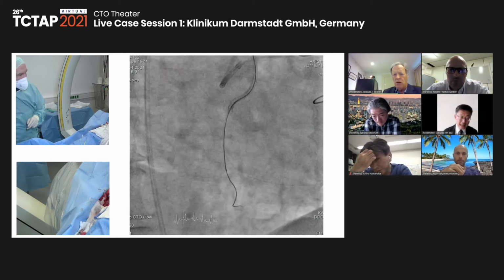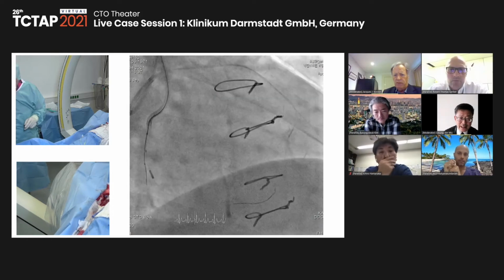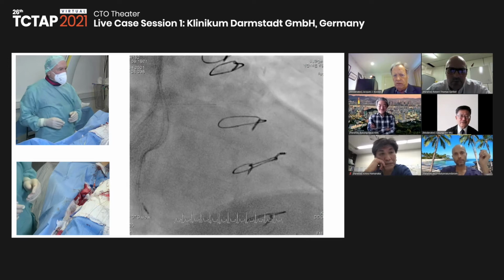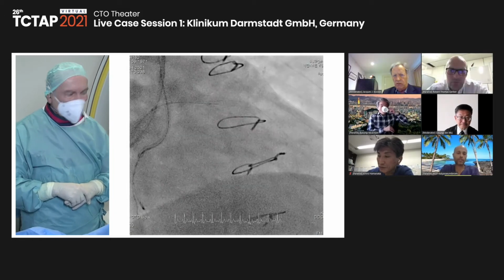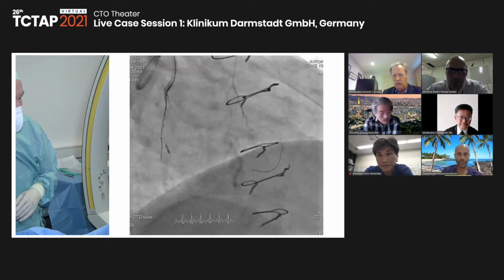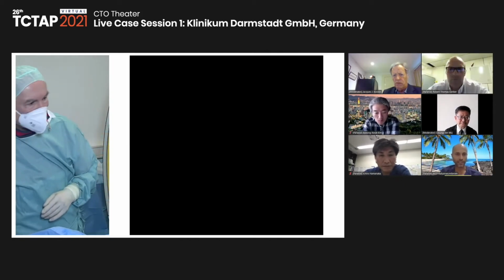So nice point here, actually, that you switch in an early stage to the retrograde. Arun, one of the questions regarding the ADR, is this a good time to switch to an ADR directly, or do you want to just go retrograde as Gerald proposed? So Sion, this is a very interesting case, and one of the questions I did have for Dr. Werner is, with the CT, we were concerned that the distal cap is really a bifurcation. Do you have a landing zone? I guess that's kind of the real question.